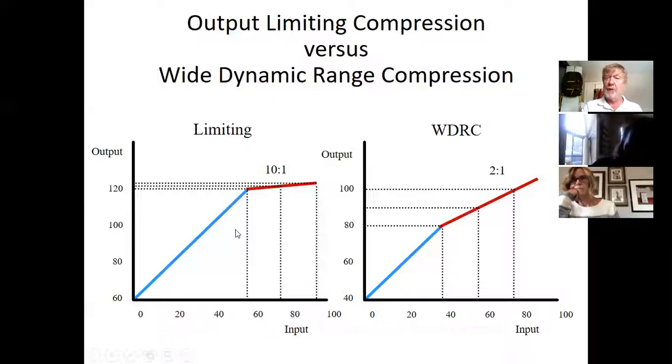You can see that the knee point is high. The hearing aid is just providing linear gain for not only soft inputs, but it's also providing linear gain for average inputs. And then suddenly slamming on the brakes. So this would be the teenager in his dad's car, seeing the stop sign and slamming on the brakes just before getting to the stop sign. Not better, not worse, just a different clinical usage. And for whom does the bell toll here? For whom is this compression intended? Severe hearing loss.